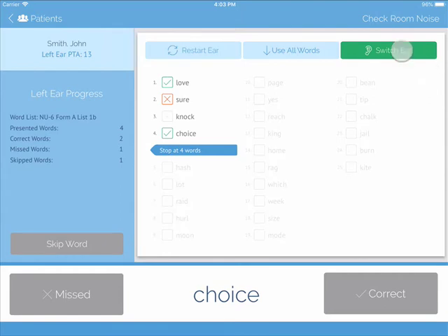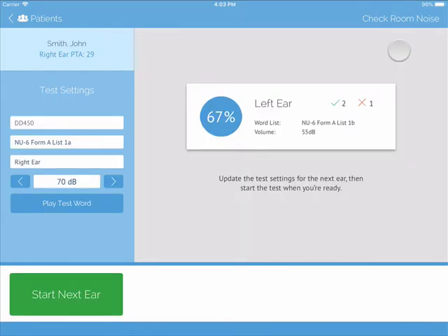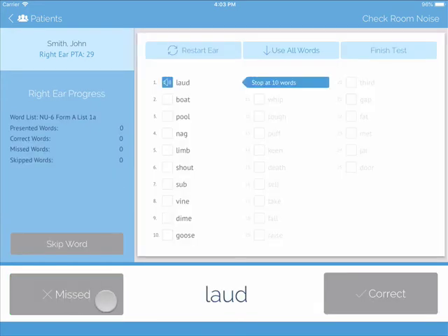When it comes time to switch ears, the results will display as a percentage. Then you start the next ear. To exit the test, press Patients in the top left.